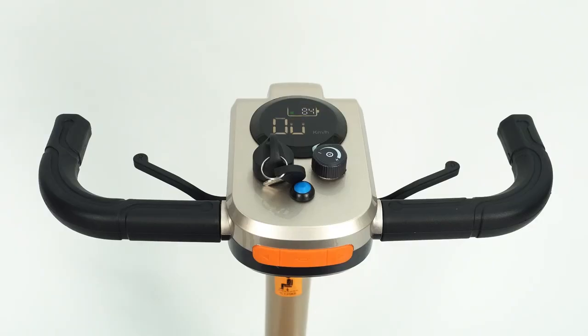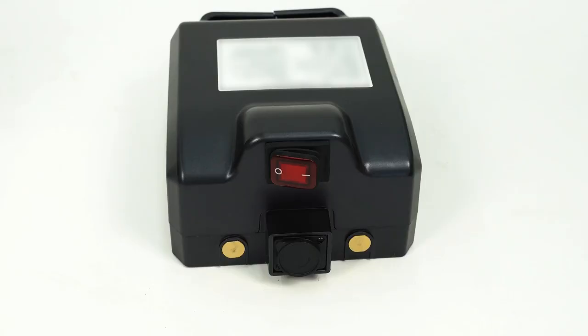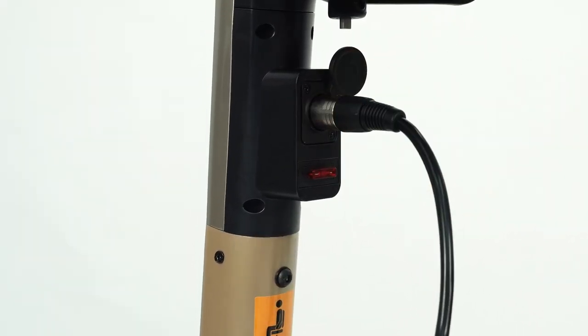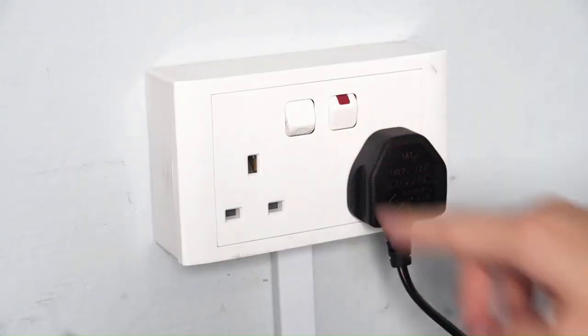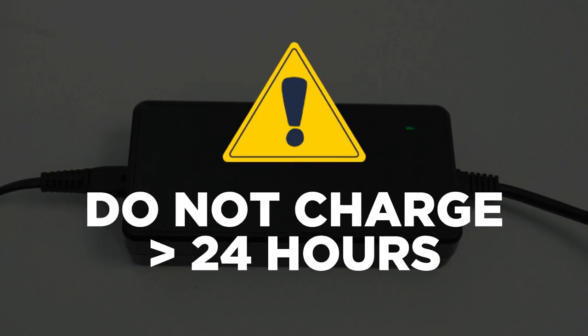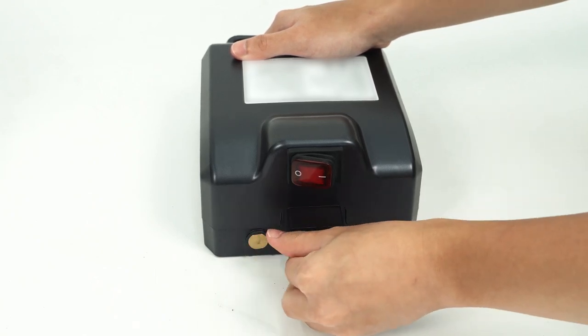Charging: Before charging, make sure the device is powered off. There are two ways to charge the Opila light. The first way is to open the dust cap to access the charging port. The second way is to connect to the battery directly. Switch on the power supply — an orange light indicator will appear. A full charge will take between 6 to 8 hours. Do not overcharge the battery for more than 24 hours. Remove the plug when charging is completed.